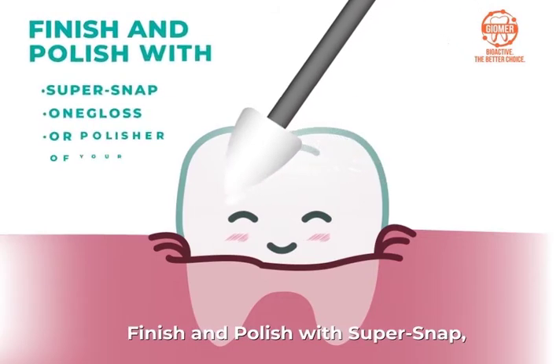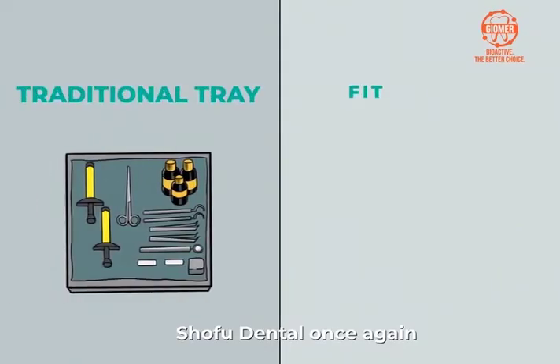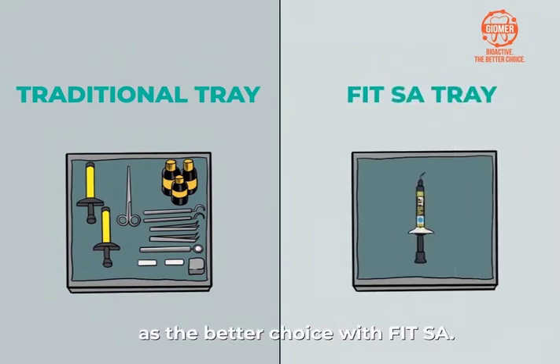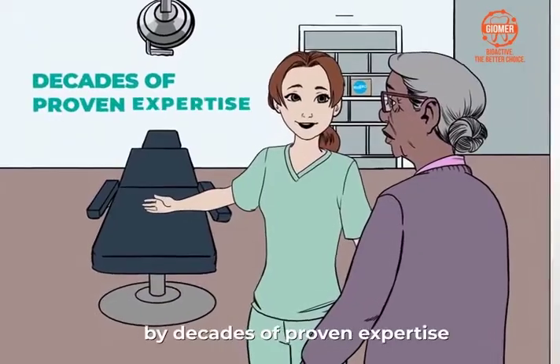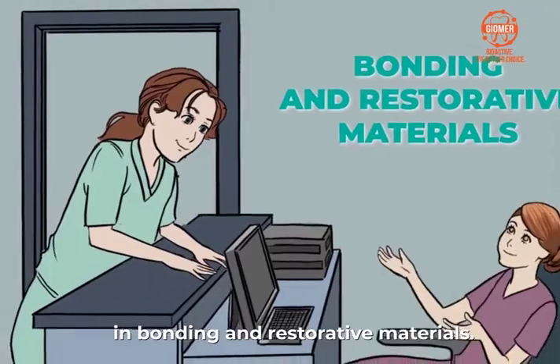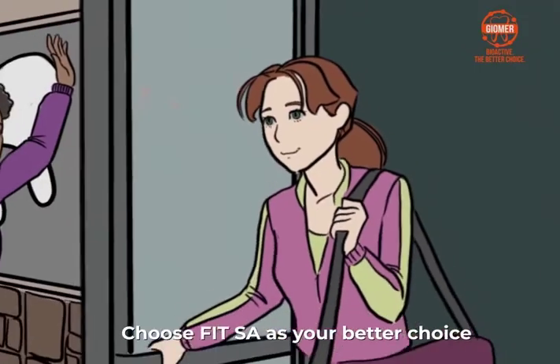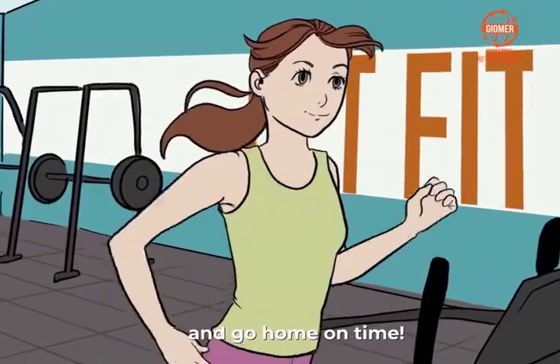Finish and polish with Super-Snap, OneGloss, or a polisher of your choice. Shofu Dental once again sets the standard as the better choice with FIT SA. This technological advancement is brought about by decades of proven expertise in bonding and restorative materials. Choose FIT SA as your better choice to serve patients, increase production, and go home on time.